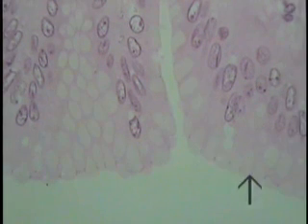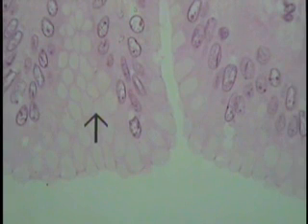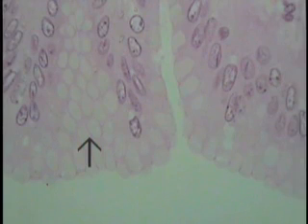So you've cut through here, flipped it up 90 degrees, and you're looking directly down or into the interior of the mucin granules within these cells. This is due to the folding and curvature of these tissues, and it's a problem that you'll simply have to deal with in developing a three-dimensional image in your own mind when you look at enough of these particular sections.